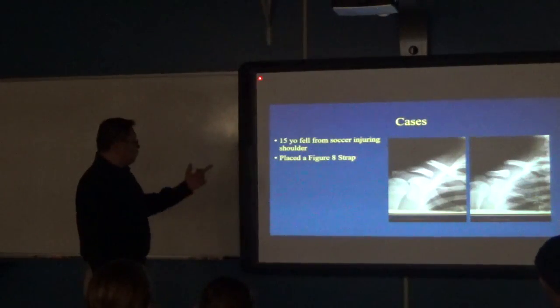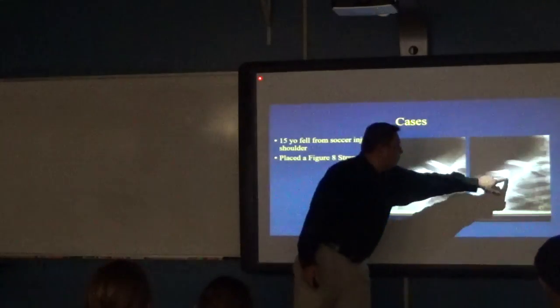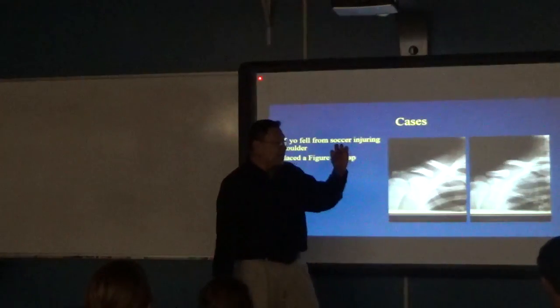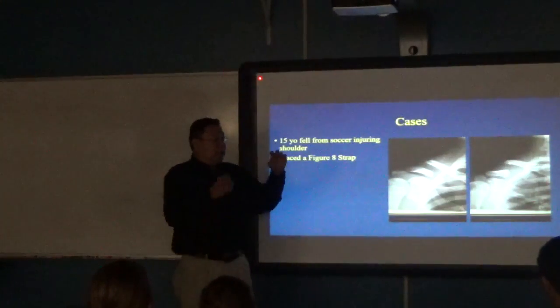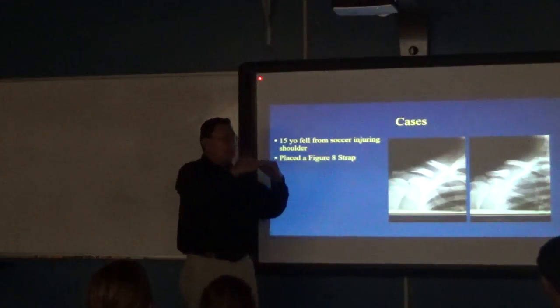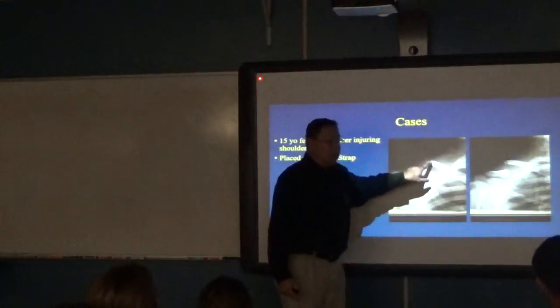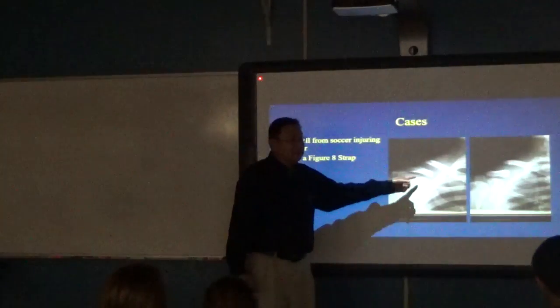This is a clavicle fracture. It's out. And if you know anatomy, in a shorter girl, this probably won't reduce. If the bones are not touching each other, studies have shown that if it's more than 5 millimeters, it's too far for the bone cells to jump to the other side. The bone has to be in contact. If there's any contact, the bone can heal. But if there's no contact, there's tissue in between these two bones. So you can leave this for 50 years and it ain't gonna heal.